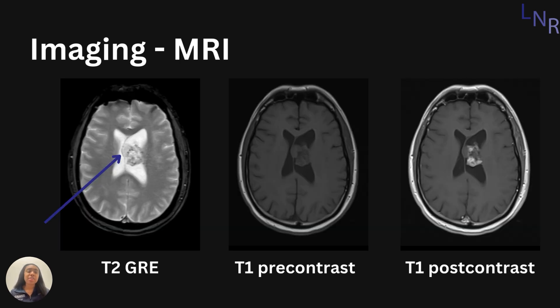There are various ways to evaluate MRI imaging. T2 is used to highlight tissue based off of water content, and here it's used to detect abnormalities where there may be increased water, like in this example, where we can distinctly see a heterogeneous mass along the septum pellicidum, highlighting the central neurocytoma surrounded by cerebral spinal fluid.